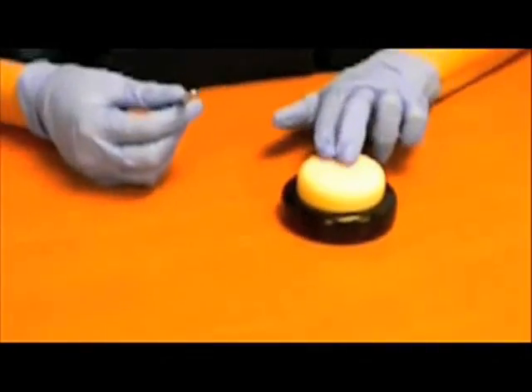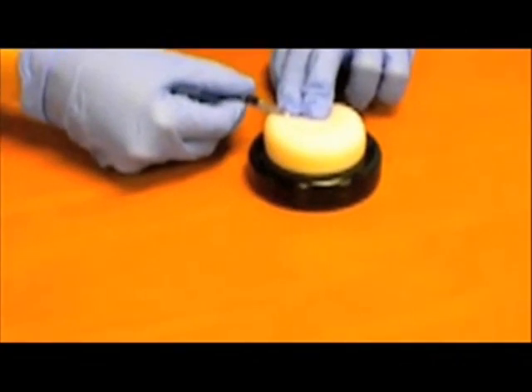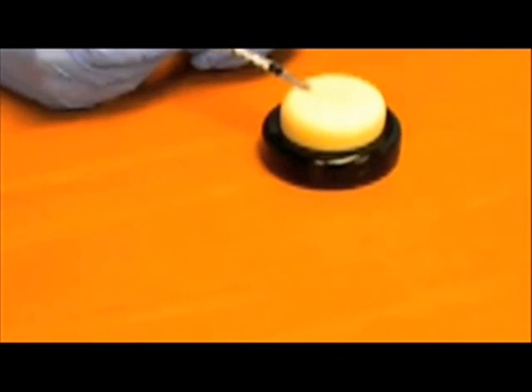I'm going to pull the skin tight and insert the needle at approximately 10 degrees, just barely in the skin, and I'm going to inject the medication slowly until you see a bubble. And there I have my bubble. Okay, there I had my bubble. It started to melt though.